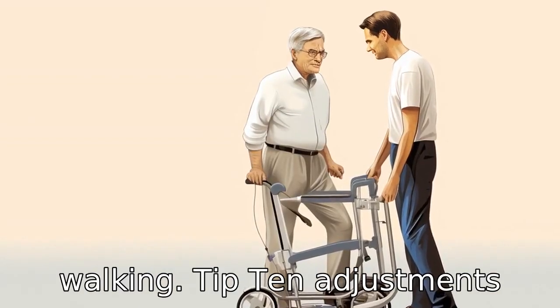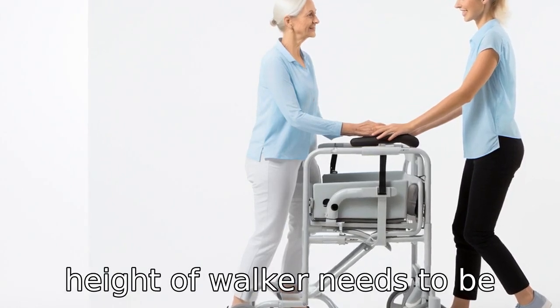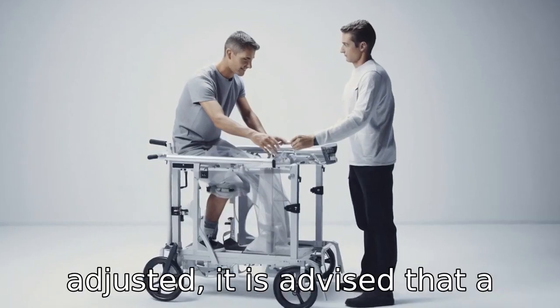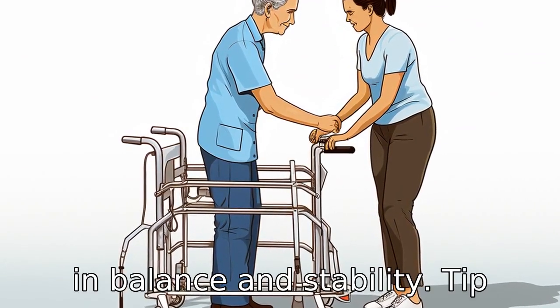Tip 10: Adjustments should be done by a professional. If the size or the height of the walker needs to be adjusted, it is advised that a professional does it. Improper adjustments can lead to losses in balance and stability.